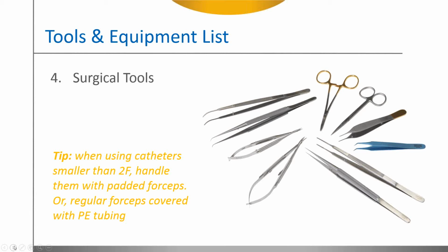Equally important with these tools is to develop a feel for how the forceps grip the catheter. Too much grip is going to leave marks on the catheter that over time are going to shorten its life. It's important to develop a soft touch that does not crush the catheter tube while using it. And we actually provide you with a practice catheter when you buy one of our catheters that you're welcome to practice with, find out where its limits are, and better understand this without inflicting any damage on a new catheter if you're not familiar with how to use them.